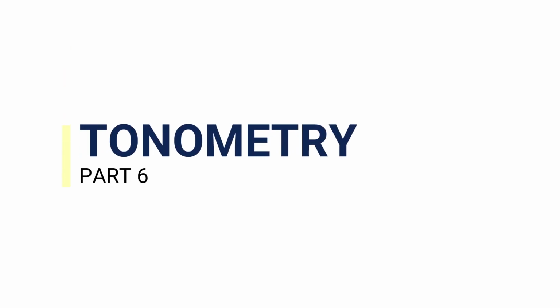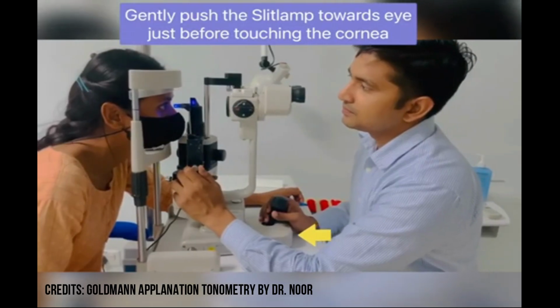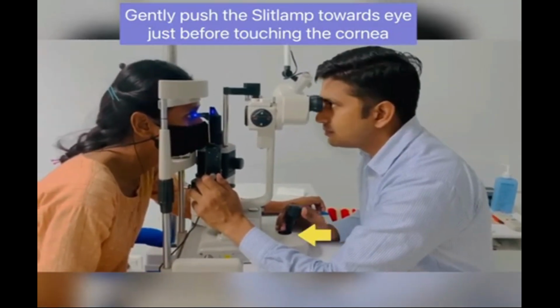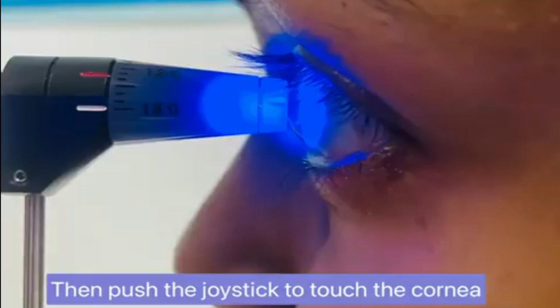The sixth part of the eye exam is the measurement of intraocular pressure. These could be assessed using different methods, examples of which are the Goldmann applanation tonometry. According to the American Academy of Ophthalmology, Goldmann applanation tonometry is considered as the gold standard. It measures the amount of force required to flatten the corneal apex by a standard amount using a slit lamp attachment that uses the blue filter.